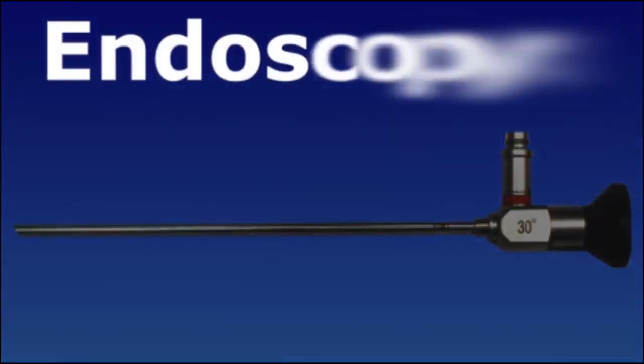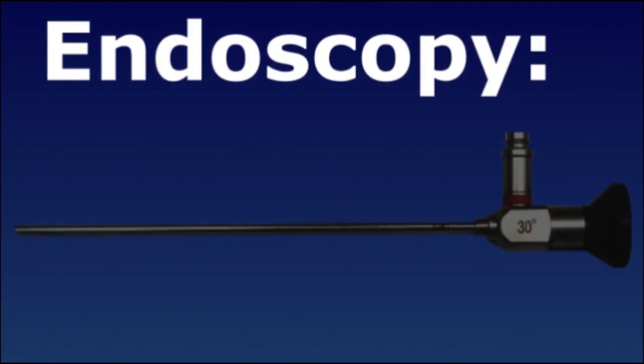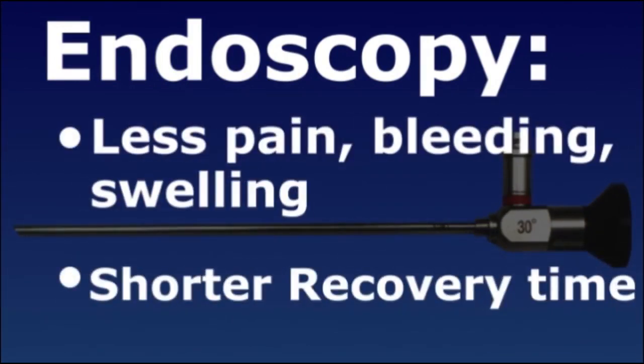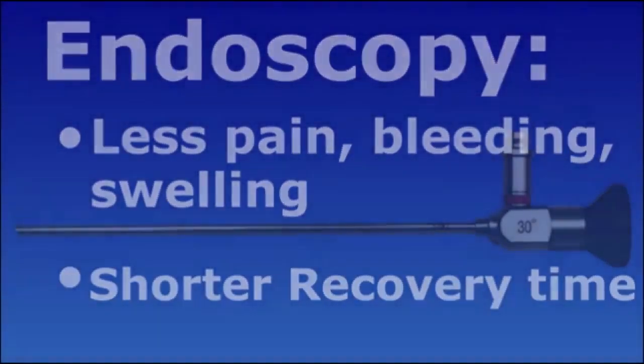Because it is less invasive, there is usually less pain, less bleeding, and less swelling, and a shorter recovery time than open surgical methods. Let's take a look at one type of endoscopic carpal tunnel release.